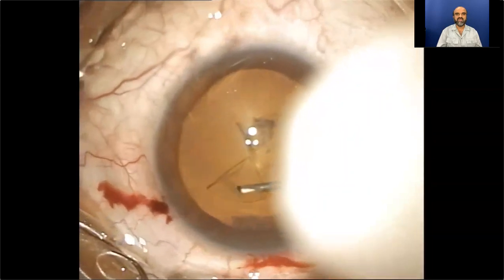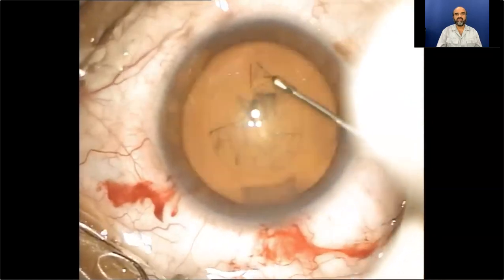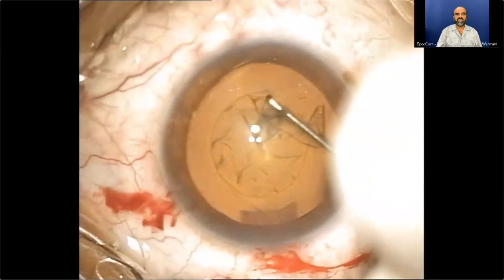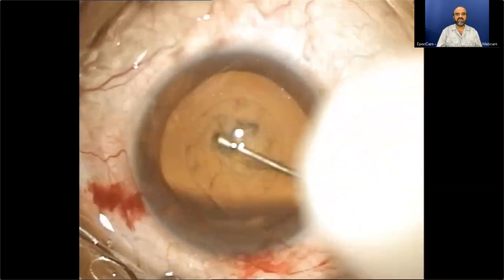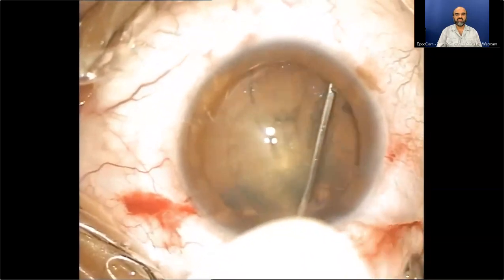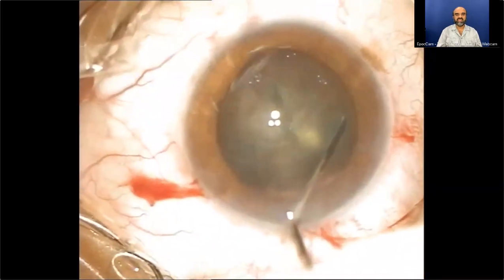The capsulorrhexis is being completed — the tongue of the capsule is averted and then the full push force is applied on the averted anterior capsule. A very beautiful round rhexis is completed. Hydrodissection comes into the picture, performed in incremental multi-quadrantic fashion.